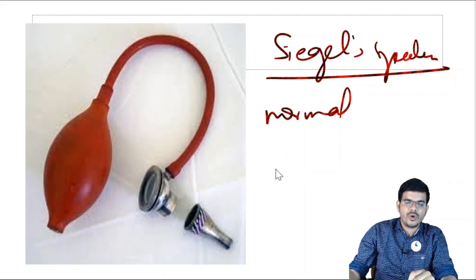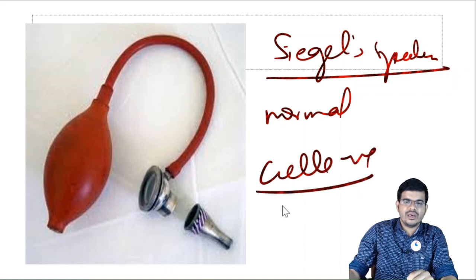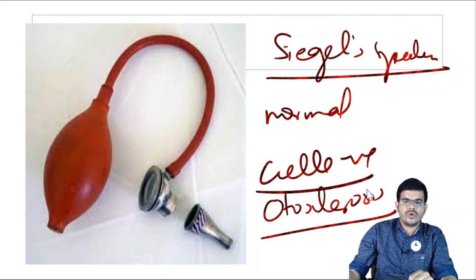If he is not having any change, Gelle negative implies the footplate of stapes is already fixed, as in otosclerosis. Okay, otosclerosis.